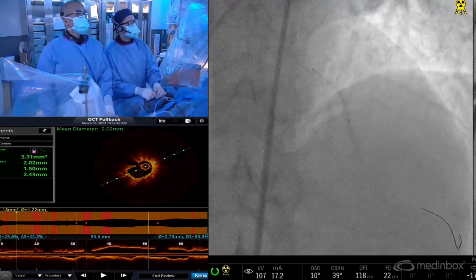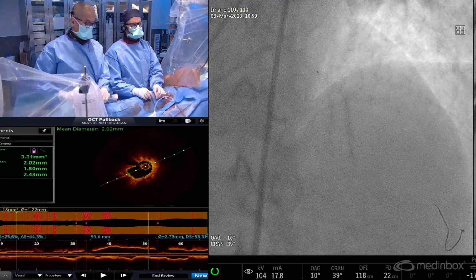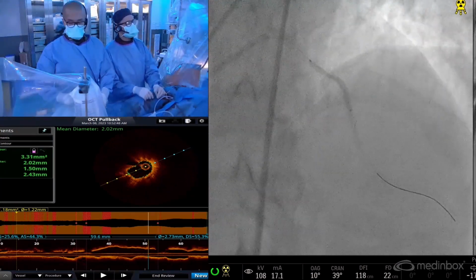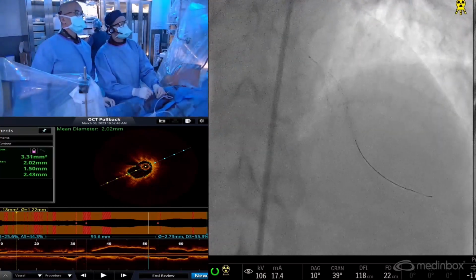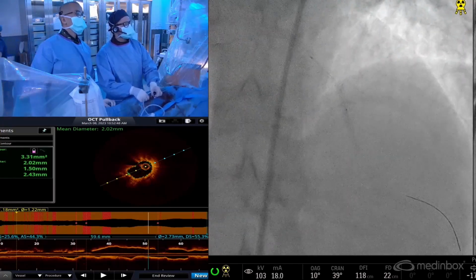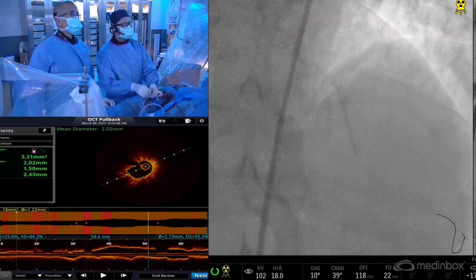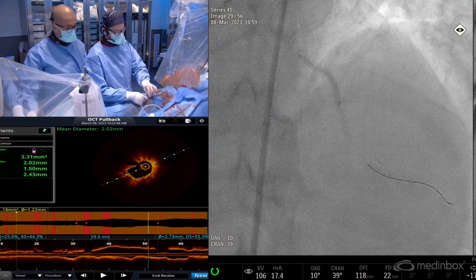We'll likely... oh, attention, guiding. Attention, ton guiding, tu vas disséquer le tronc. You want to open up? Attention à ton guide, c'est allemand aussi. On était à 12, là on était à 16, 18. So we're going to likely head into a... There is some resistance here. Dégage, ouais. Ouais, c'est correct. Good. Yeah, the wire, I saw that.